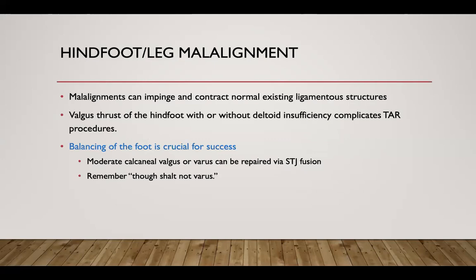So hindfoot and leg malalignment. Malalignments can impinge and contract during normal gait cycle and affect the ligaments surrounding it. So whenever you are doing a replacement, you have to make sure the foot is balanced. And always remember, if you have to leave the foot, you can't leave it perfectly rectus, leave it in slight valgus, thou shalt never varus. Always remember that.